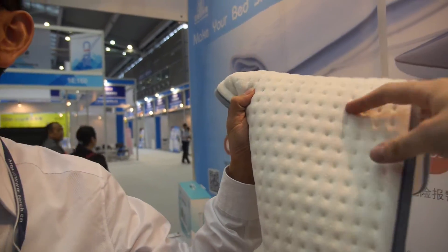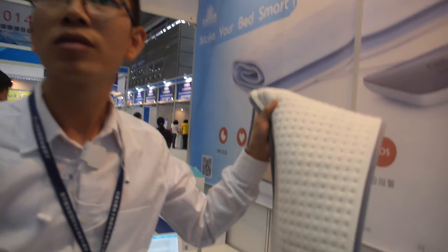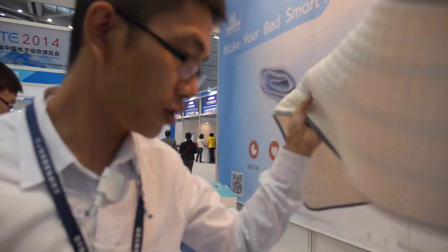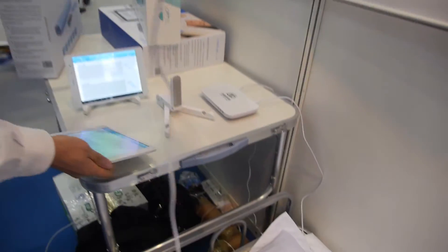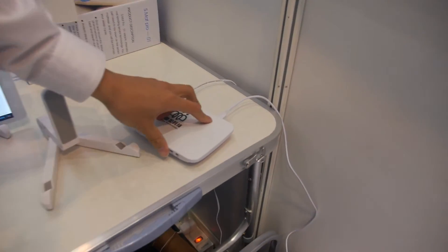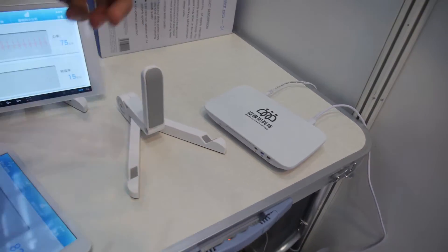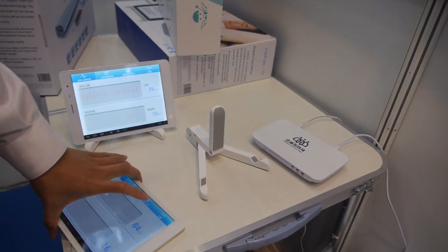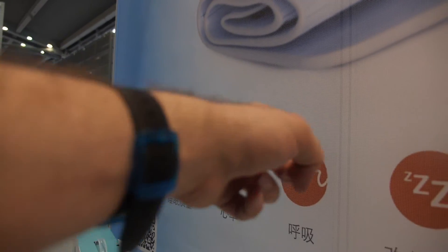There's a USB — this cable needs to be connected to this control box. The control box processes the signal and communicates with your mobile phone or tablet.